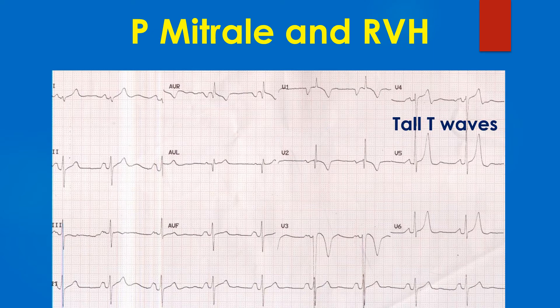The T waves in V5 and V6 are unusually tall. The lead 2 rhythm strip at the bottom of the tracing documents a normal sinus rhythm, which can at any time degenerate into atrial fibrillation in this case with gross left atrial overload.